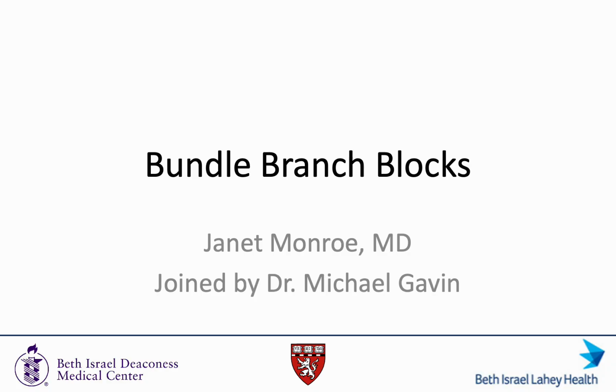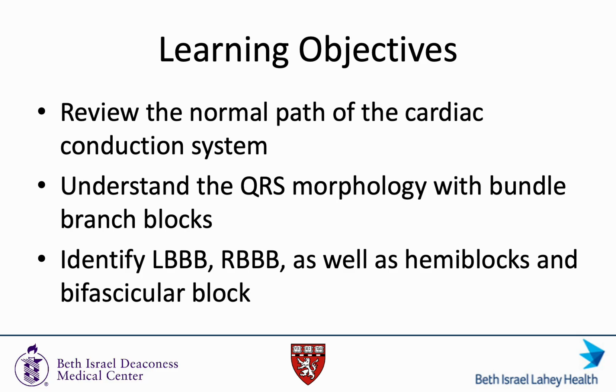I'm Janet Monroe, PGY3 at BI, and I'm joined by Dr. Michael Gavin today to discuss bundle branch blocks. Our learning objectives today are to review the normal path of the cardiac conduction system, understand the QRS morphology with bundle branch blocks, and identify left bundle branch blocks, right bundle branch blocks, as well as hemiblocks and bifascicular block.